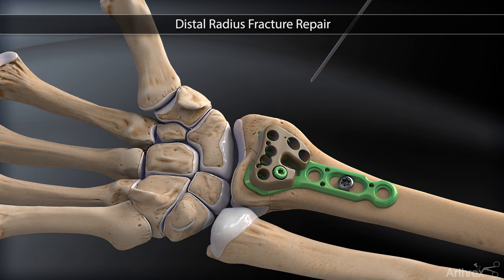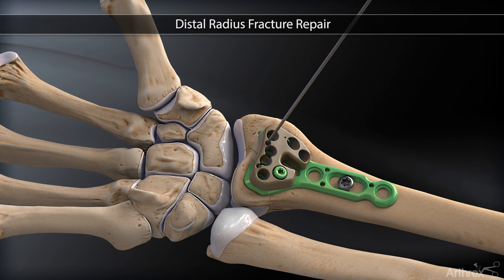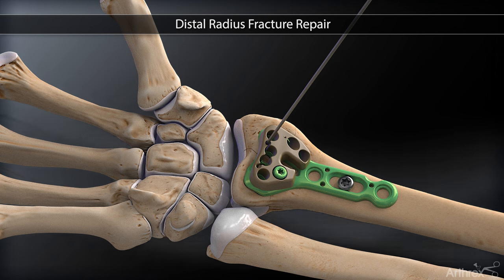K-wire holes in the distal aspect of the plate accept 1.35 millimeter K-wires, which can be used to assess distal-proximal placement of the plate. If the K-wires are proximal to the joint surface, then all fixed angle screws will be proximal to the joint surface as well.